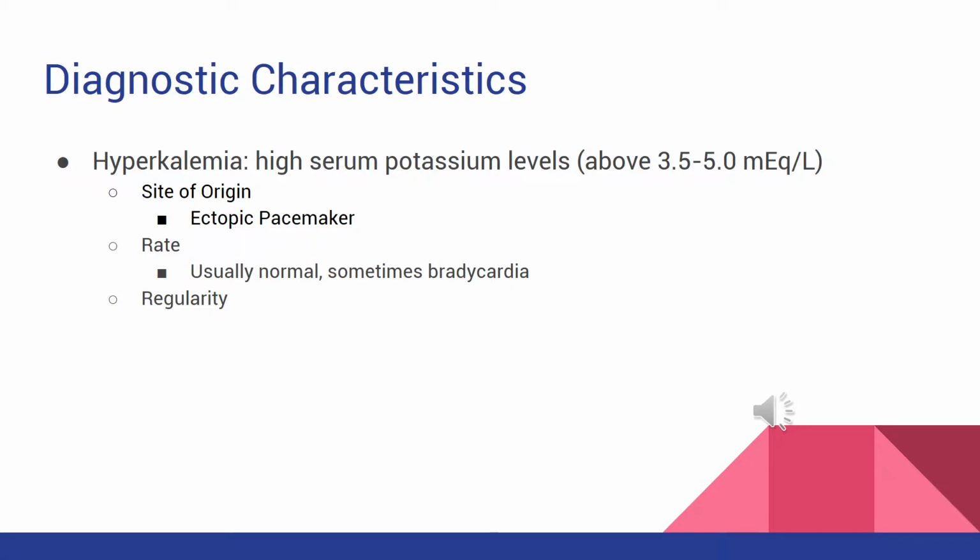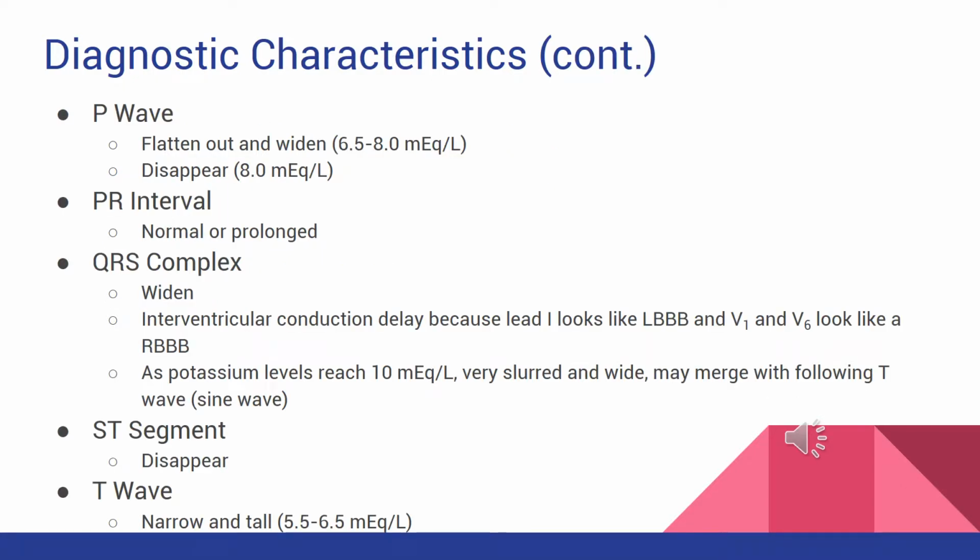And as for regularity, we were not able to find any notes about regularity specifically for hyperkalemia, but with some EKG strips we found, it did look like they all had a regular rhythm, but we can't assume that that is the case for all hyperkalemia cases. So now into the specifics of the EKG strips.